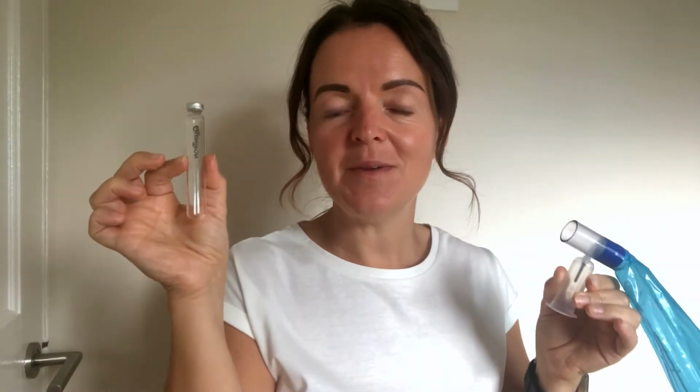Okay, so that's the first one done. So now you need to drink your lactulose solution.